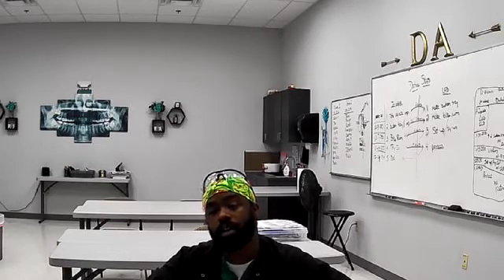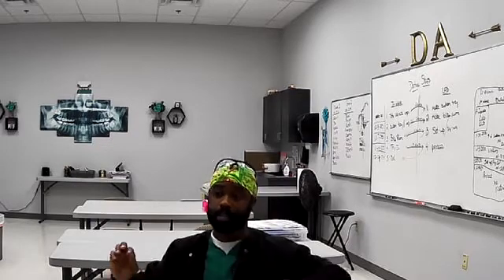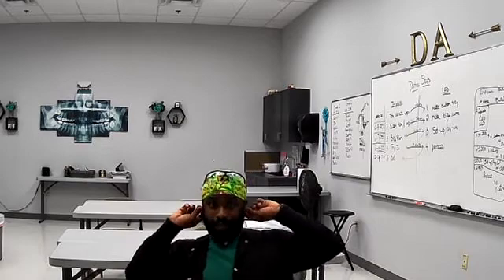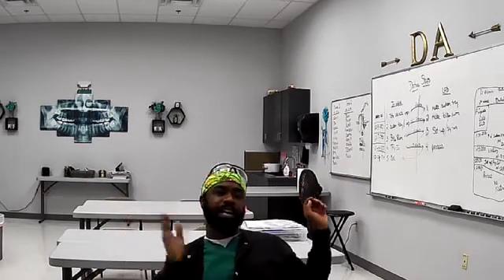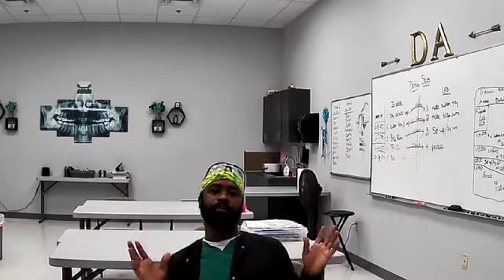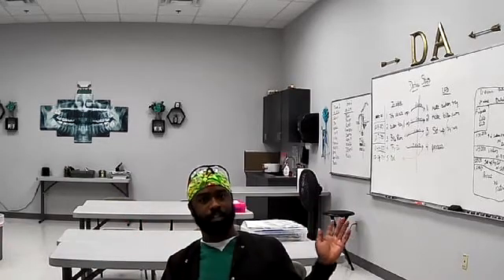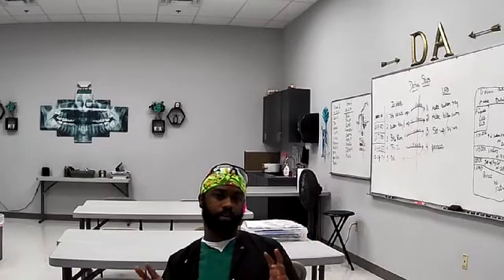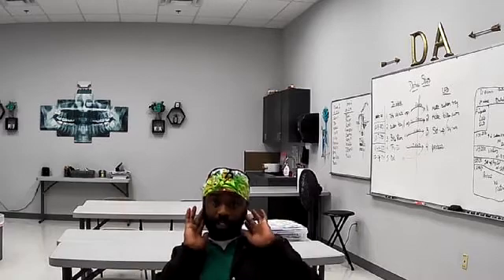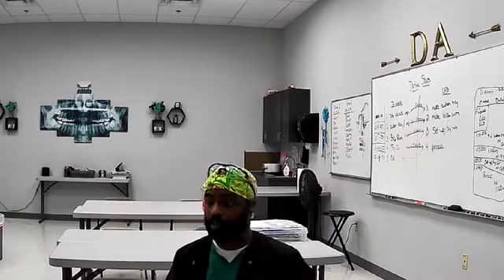X-rays. Earrings, whenever you take in a panel, are definitely a no-no because not only will it take the picture of the earrings, but it'll also throw off a glare. It's kind of like a ghost glare that'll go over the image. So even though you could see certain things, it'll be super blurry or really foggy because of the earrings and their little ghost image that it'll throw off.